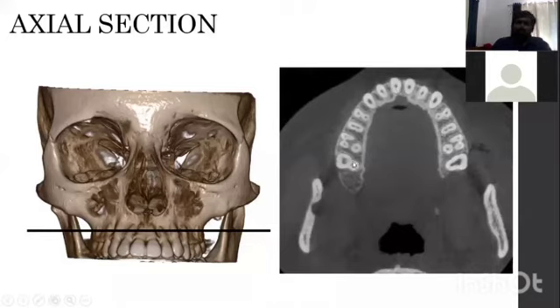This is used in endodontics to appreciate the morphology of the root canal or root. Like here in this picture, we can also see a three-rooted molar, with the mesiobuccal root, the distobuccal root, and the palatal root. By looking at this, we can appreciate a missed canal, any fractured instruments, root morphology, like that.